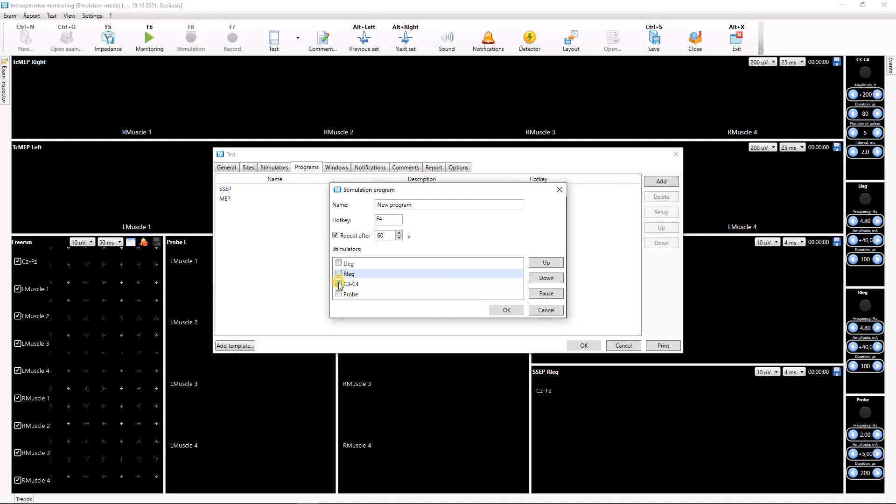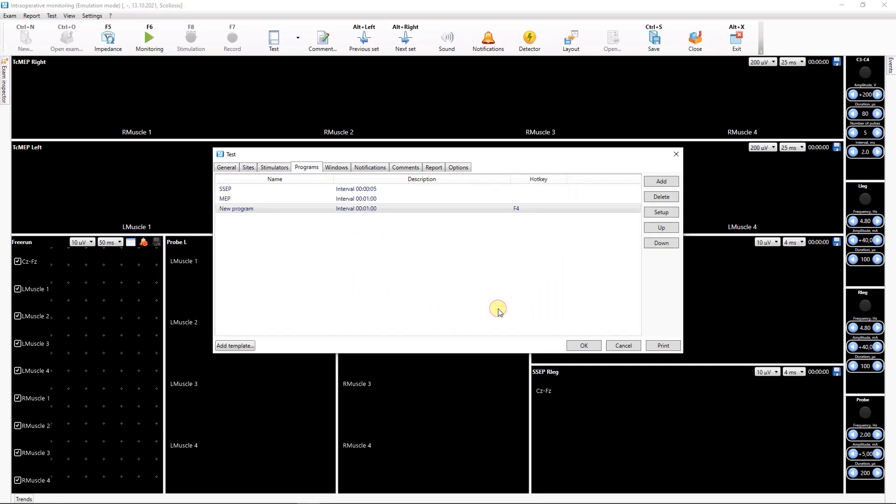After Stimulation program settings are adjusted, click OK and newly created program appears on the list.